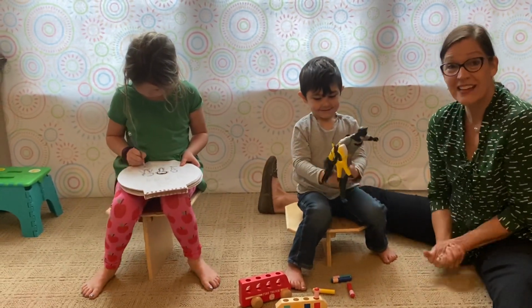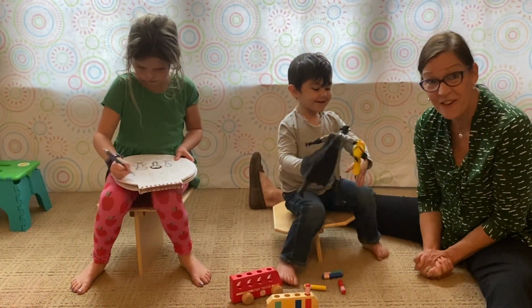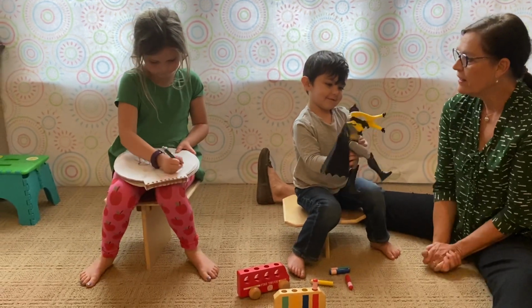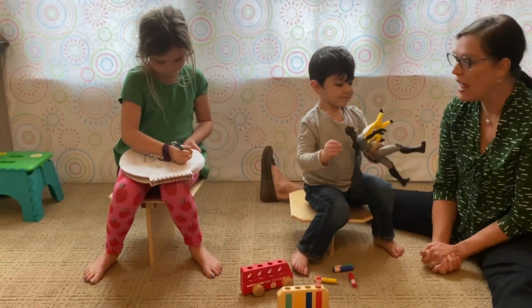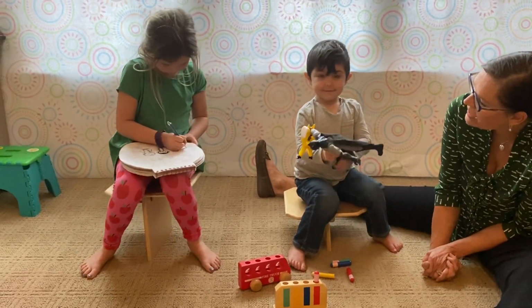Anyway, I cannot say enough about the benefits of a T-stool. Their feet are touching the ground. They're grounded, stabilizing, trunk extension, automatic balance. And look at him.